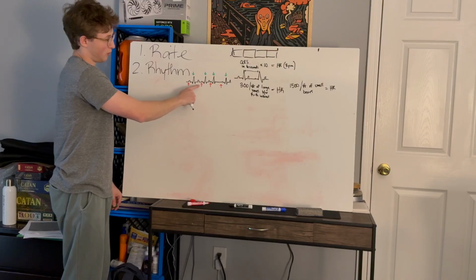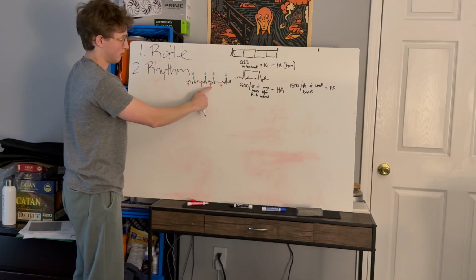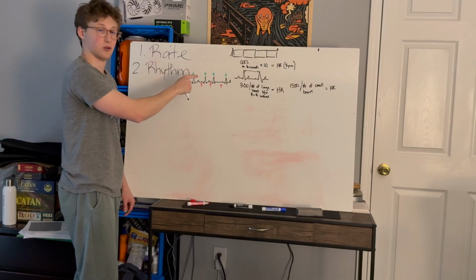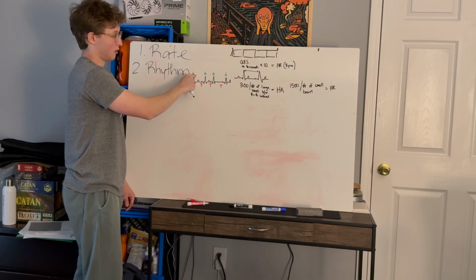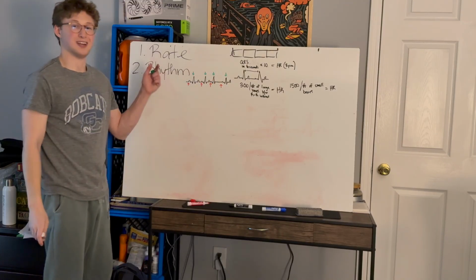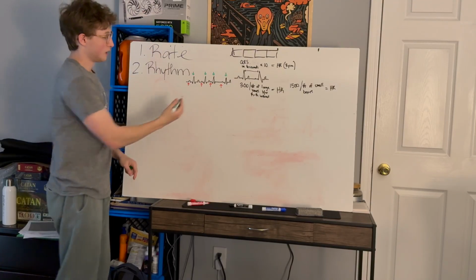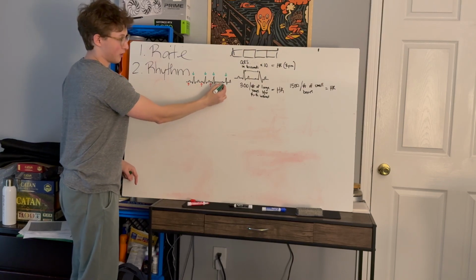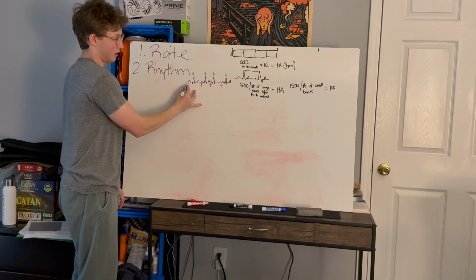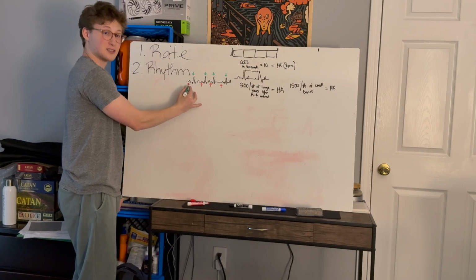If you look at these P waves, you see that, okay, well, look at this one. It gets a little bit shorter, and then it kind of goes back, but it's still not quite the same. Look at the R to R interval. Look at these QRS complexes. Okay, we got this distance, then it gets shorter and back to normal. So this would be an irregular rhythm. The time between each ventricular depolarization is not consistent. Or you could look at it this way: the time between each atrial depolarization is not consistent.